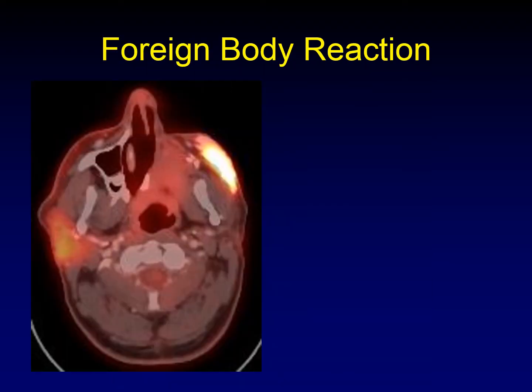How about foreign body reactions? When a patient undergoes surgery for head and neck cancer, we do all sorts of manipulations. One of them might be insertion of a foreign body.